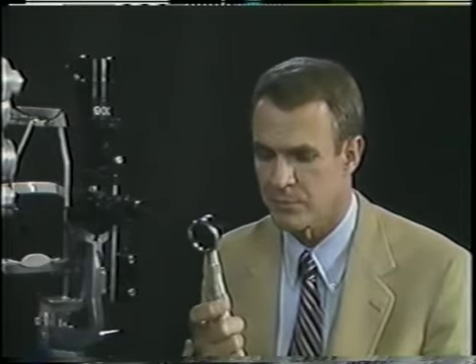For demonstration in this program, I'll use the basic Copeland streak retinoscope. It's widely used, simple, and the sleeve is easily visible. In some situations, the other retinoscopes may be superior, especially when increased light is helpful in retinoscoping through small pupils or through immature cataracts. On the other hand, the extra brightness can be annoying to some patients, especially to children. Remember when I remind you to hold the sleeve all the way up in the remainder of the program, if you use one of the non-Copeland scopes, hold the sleeve all the way down.